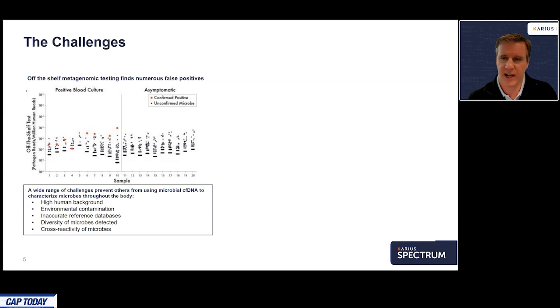And it gets challenging to sort out which came from the reagents or plastic surfaces and which came from the plasma itself. In many cases, that environmental contamination signal will even be much larger than the signal from the pathogen. So we spend a lot of time solving that.